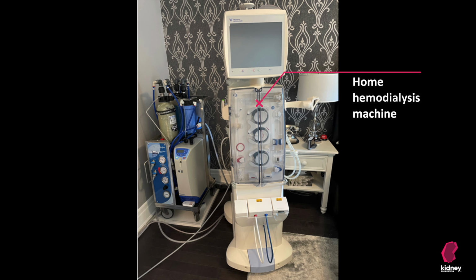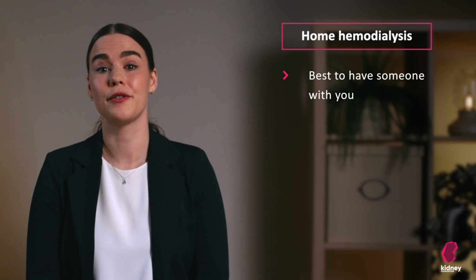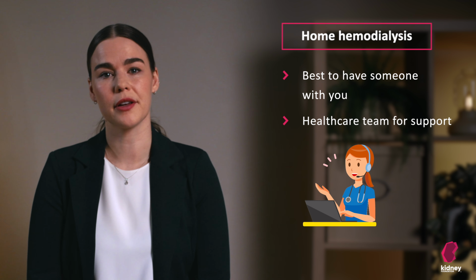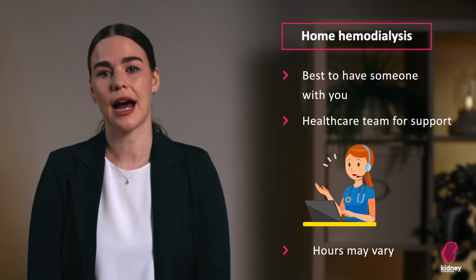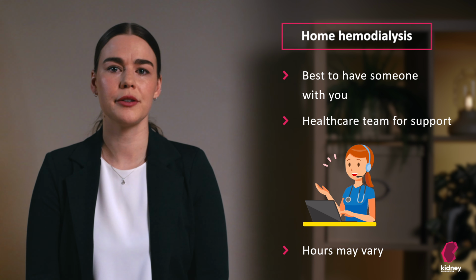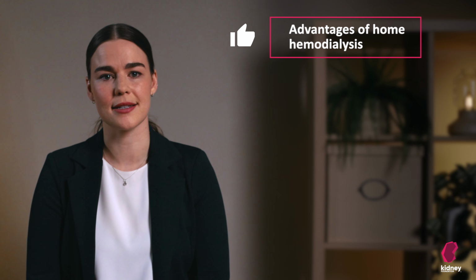The hemodialysis machine and water filtering system are provided to you. The water filtering system has to be installed in your home to ensure the water used for dialysis is very clean. It is best if you have someone with you during your treatments. You can call your healthcare team for support. The hours during which you can contact your care team may vary, so we invite you to inquire with your care team directly.